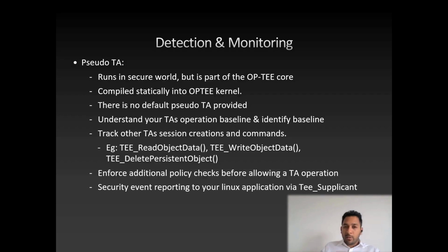So this is how it should be used, but there is no default pseudo TA provided, but you can build one. The communication from the pseudo TA to your application on the Linux side is happening via the supplicant. It's a separate component. I'll talk about that in a bit.